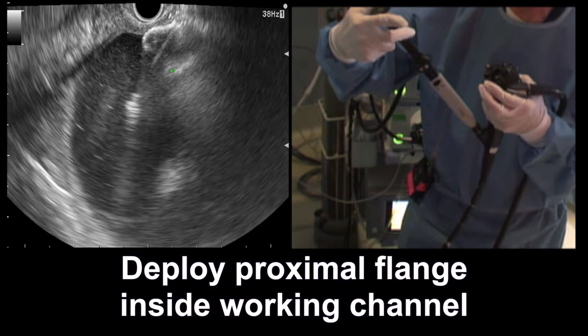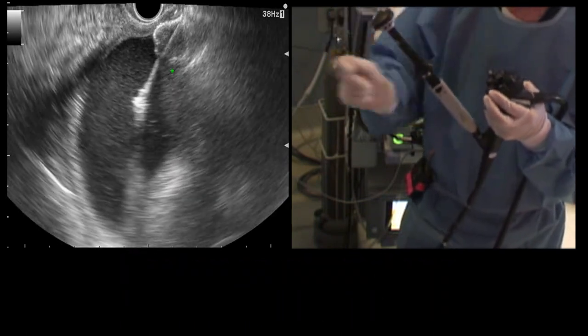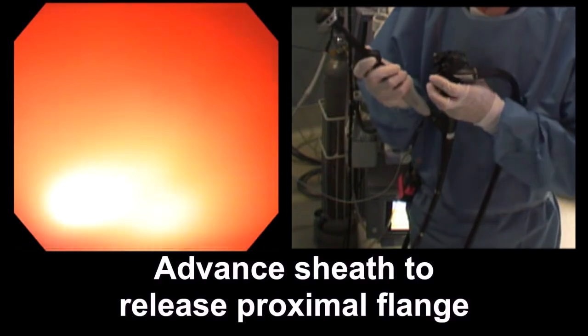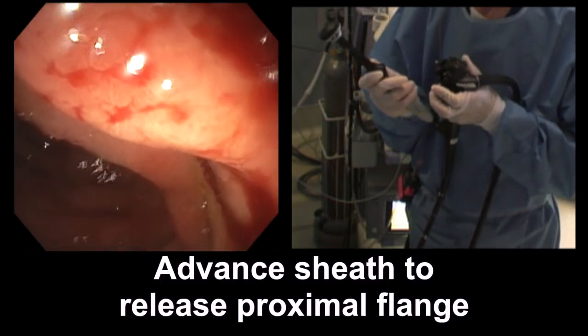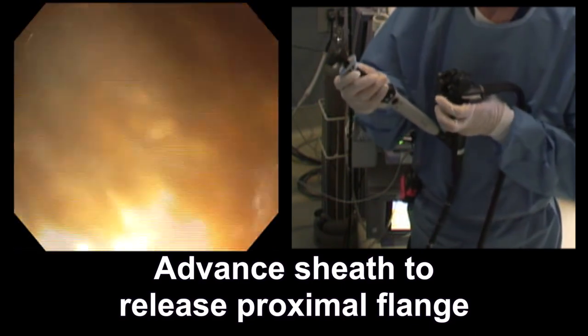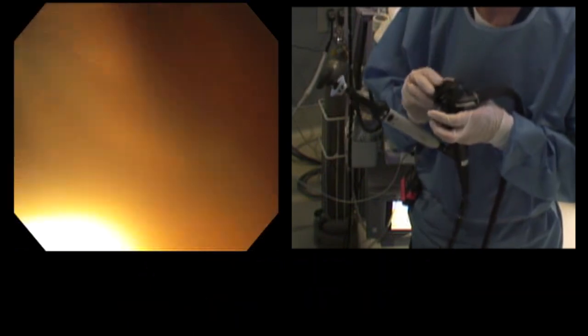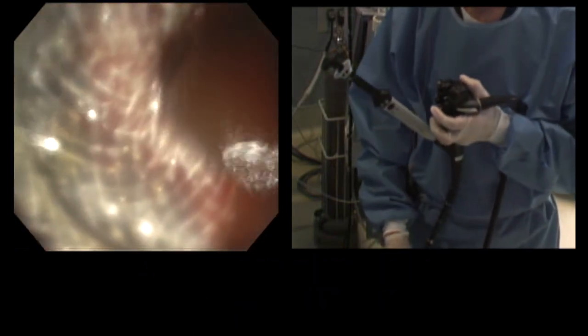The proximal flange will deploy inside of the working channel of the scope. I'm just pulling back all the way, and now we're going to switch to the screen. As I pull away from the wall, I'm going to advance and push the proximal flange out. You can see there's already ample fluid gushing out.